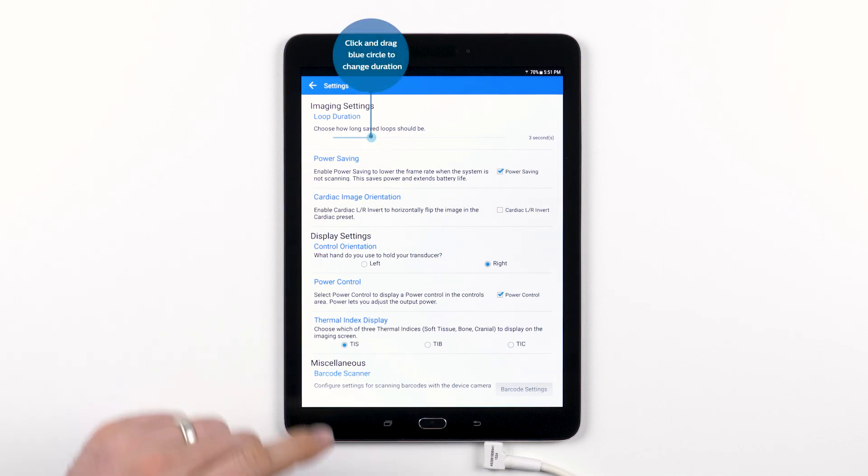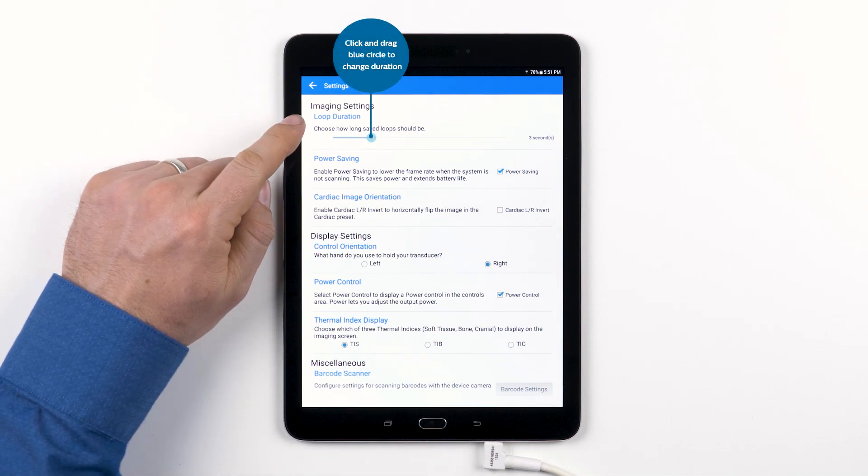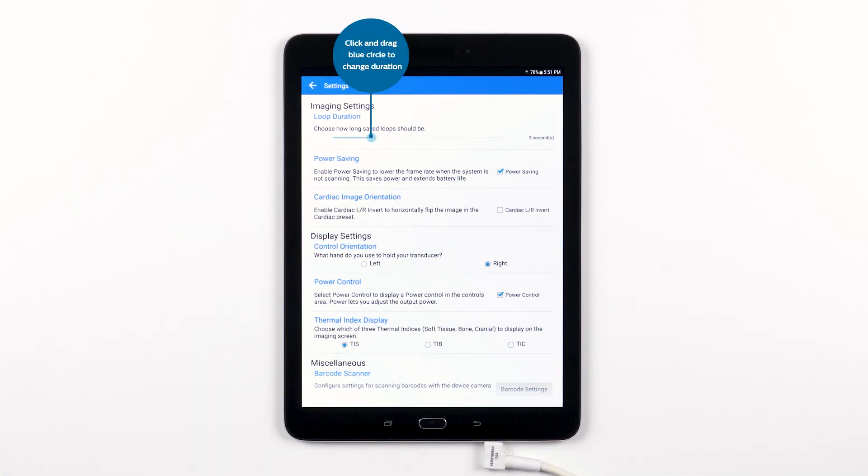The very top setting allows you to choose the duration of the ultrasound loops that you want to save. You can set the length to be anything from 1 to 10 seconds.